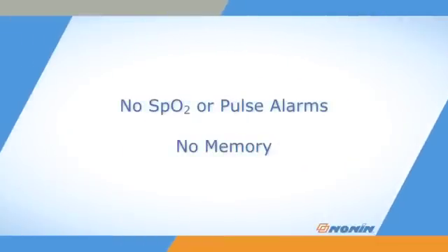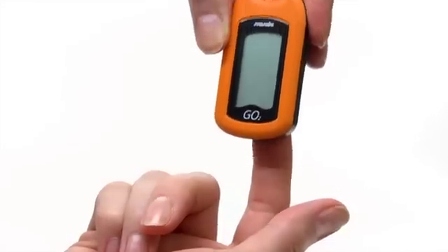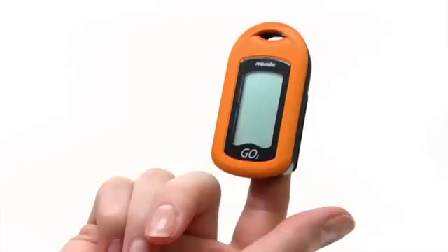The GO II Oximeter does not have alarms and is designed for periodic spot checks. It also does not have any memory. If any LCD elements do not appear as expected, remove the unit from use. If the screen remains blank when you insert your finger, check that the battery is inserted properly and that the finger is warm, or try a different finger.